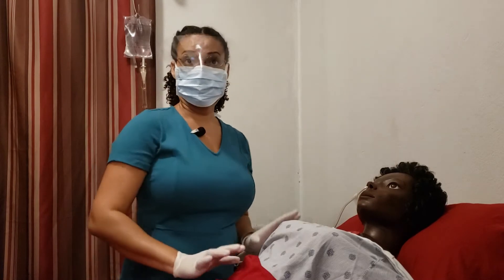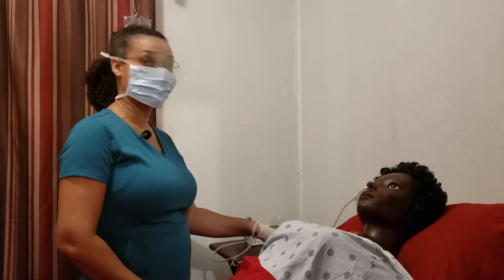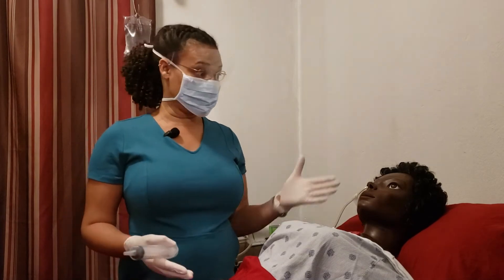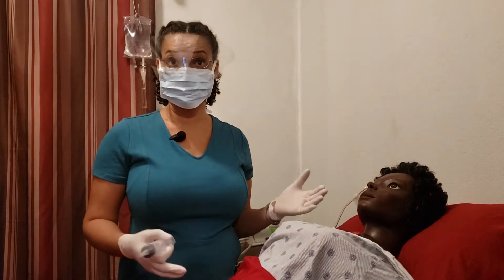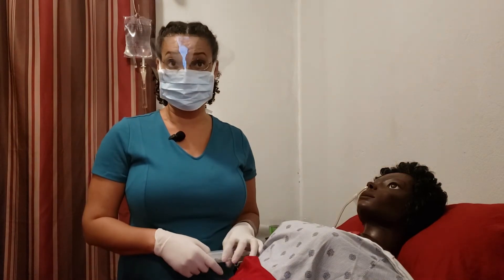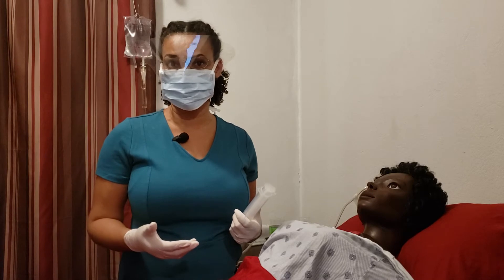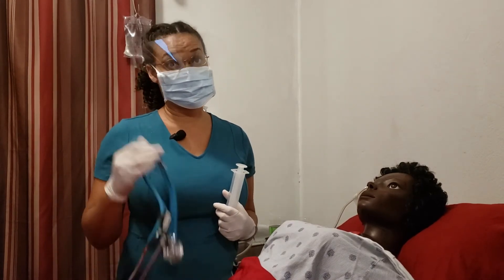Get yourself a 60 ml syringe and you are going to check for placement. During the passage of the NG tube, you check for placement. You insufflate by pushing in maybe 10 to 30 cc's of air into it and listening for it with your stethoscope.